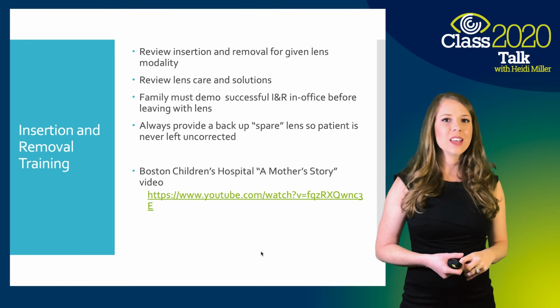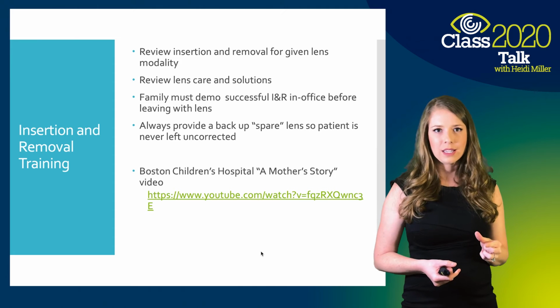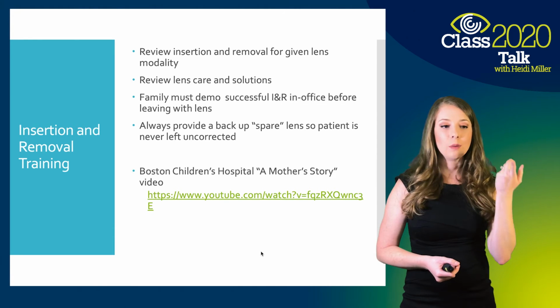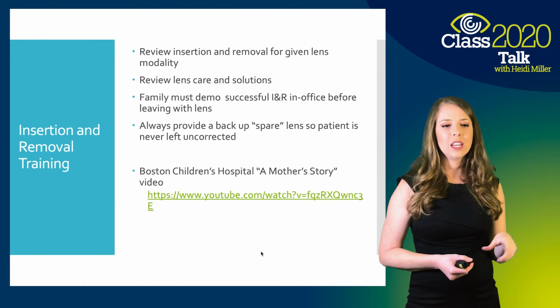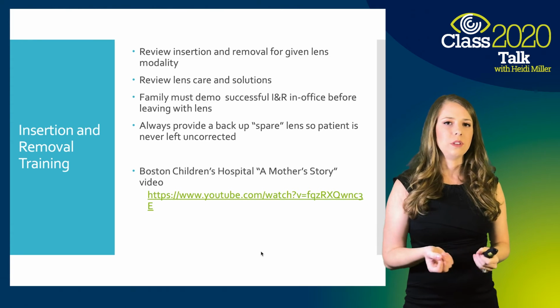And I have them watch that on the day that we're going to have them do insertion and removal training, just as a brief overview of what to expect. Then we go through the INR, and then they have that reference video so that if they go home and forgot something that we said, they could watch this video, and it's kind of a reinforcement of techniques on how to insert and remove those soft lenses.